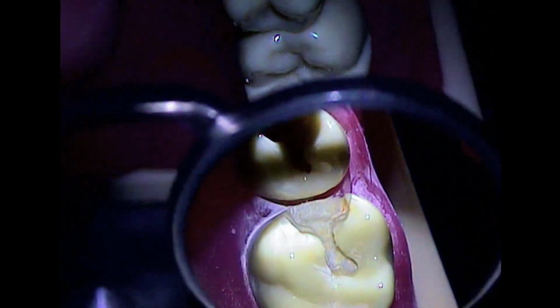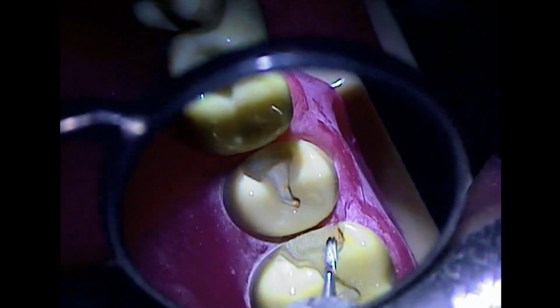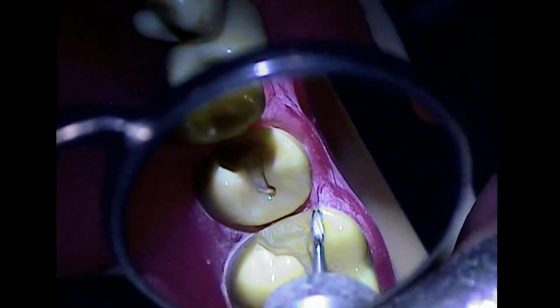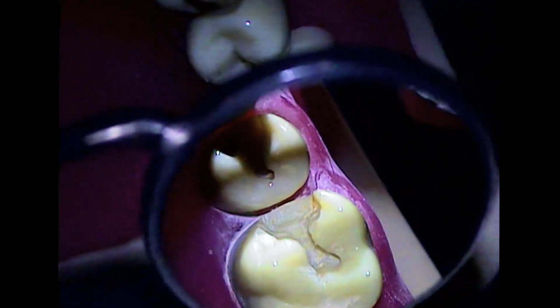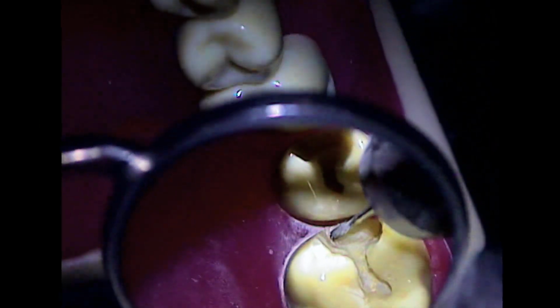Okay, so your MO, I corrected the facial wall a little bit for you. Remember I did the top of the facial wall and then I left a little step at the bottom and you were going to get rid of that, right? A lot of times I'll do half of something and then let you do the rest and follow what I did first. And that will guide you a little bit more when you're doing what you should be doing. So again, you can remove this step at the gingival part of this wall.